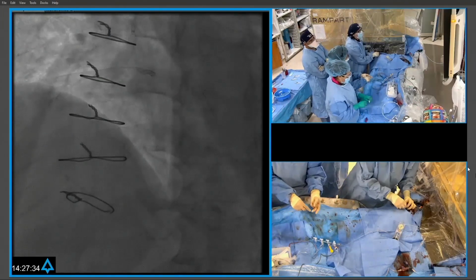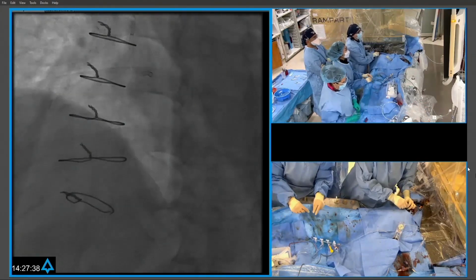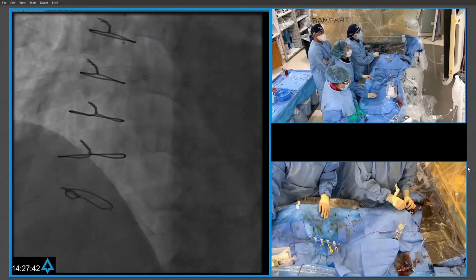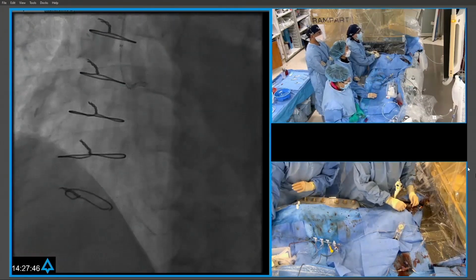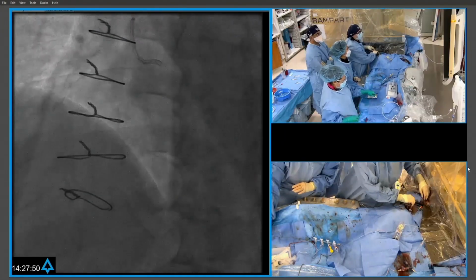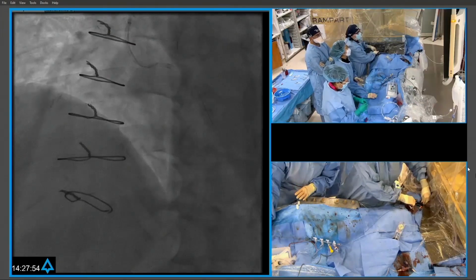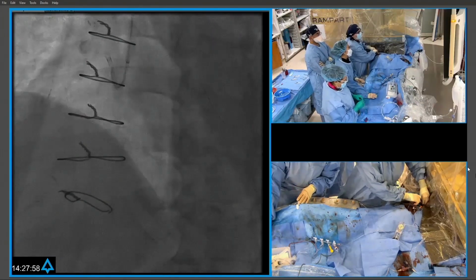Yeah. So I think that the key thing is that there are so many different choices out there, and you want to simplify, and you want to know your equipment well, which means you have to use it pretty frequently. And so what we've decided in this case is, you can debate side holes versus no side holes on the guide, but basically taking an aggressive guide so that support is going to be less of an issue. We have as backup a Trapliner.